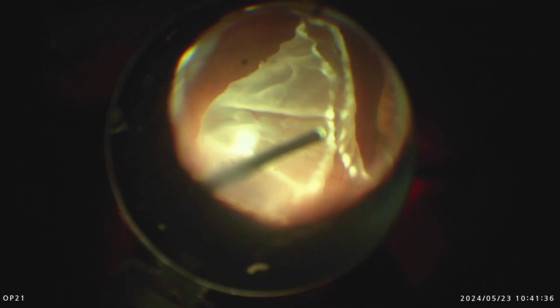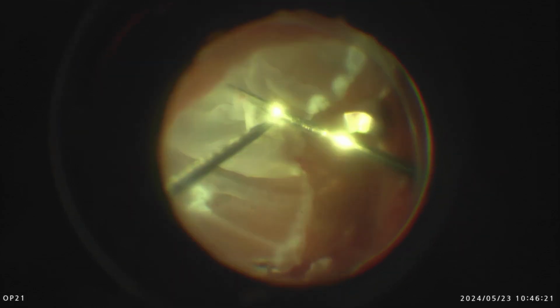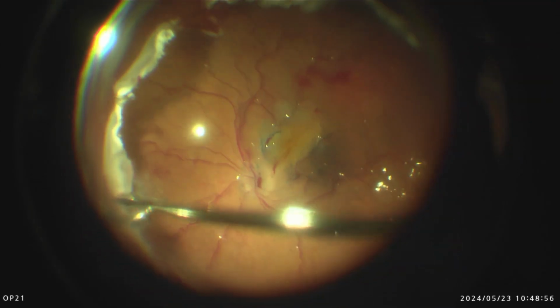And someone begs to ask the question, are these cases operable? And the answer is, it depends how long they've stood and the status of the macula. And obviously the status of the macula you can't know until you've gone into the eye, but if the patient has had vision less than a year back, meaning the detachment is less than a year old, and is willing to undergo surgery, then I do offer them this possibility. At least they will get some central vision, although very poor vision.